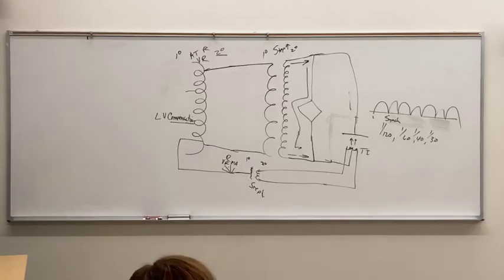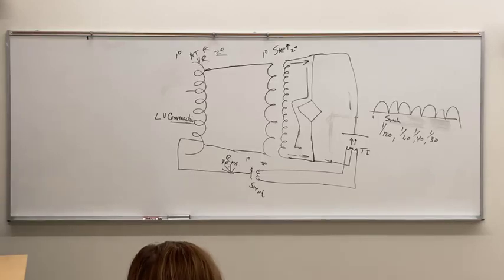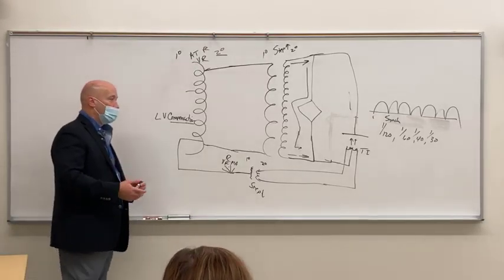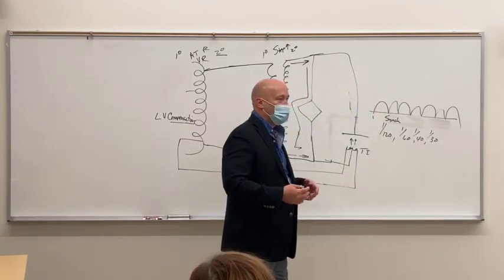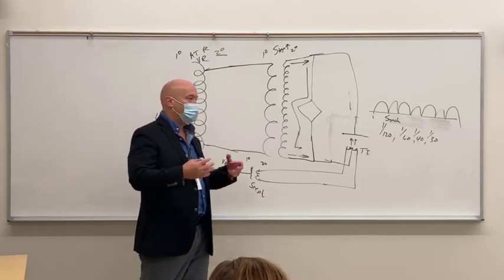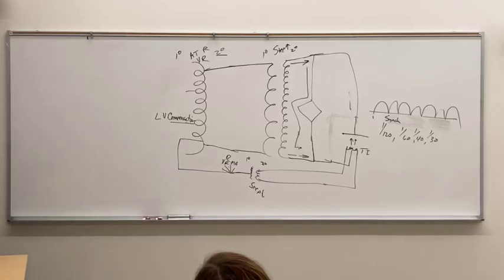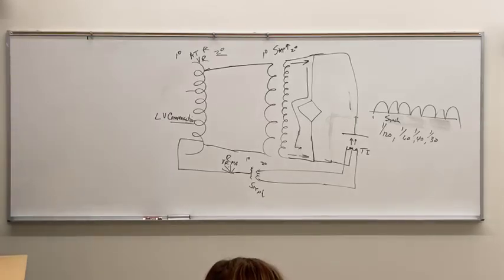So that was that. So we talked about voltage rectification, high voltage generator. We did in the last section. Voltage rectification was a process of changing alternating current to direct current. We still have pulsating direct current. We're never really going to have non-pulsating direct current unless possibly we're dealing with a machine that works directly off of the battery and doesn't run through all this stuff. I can't imagine where you would see that. So it's also always going to be pulsating direct current. It's just that the pulses get smaller and smaller, and that's what brings us up to today.